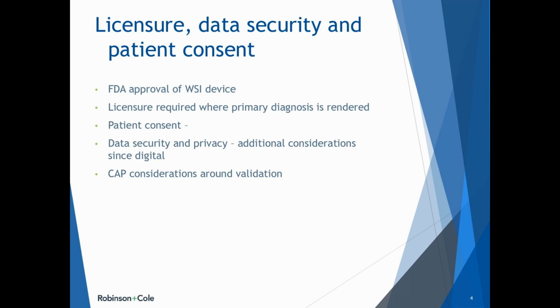And then, you're still adhering to state regulations on pathologists, even if you are using AI to some degree. Take New York, for example: you still have to have a licensed pathologist to examine and report out all histopathology cases, and gynecological cases with certain abnormalities and things of that nature. Even if you're using artificial intelligence or machine learning in digital pathology, those applications still apply. So make sure that you consider all of that.